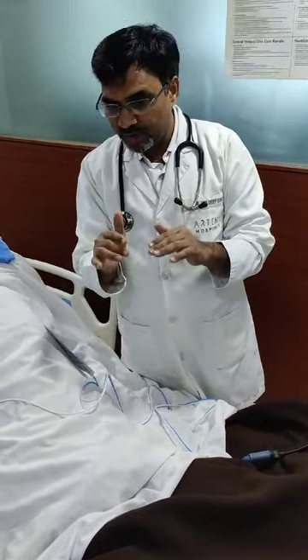Ultimately we may need to switch to intravenous pacing or permanent pacing depending upon the patient's condition. I think this is all about the cutaneous pacing. If there is anything, you can ask questions related to it.